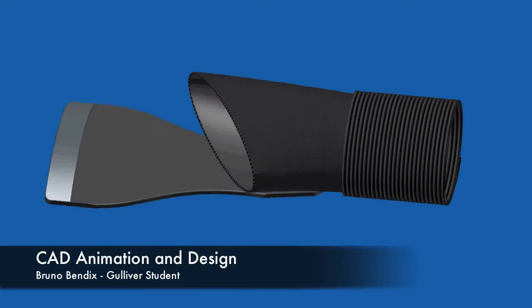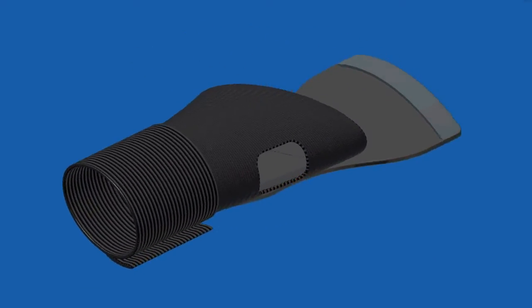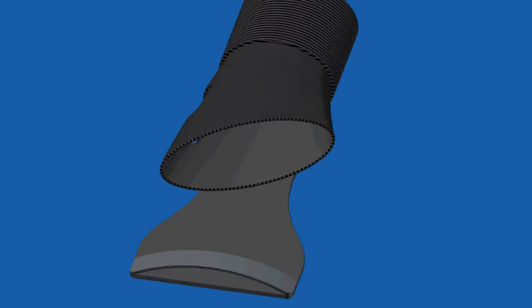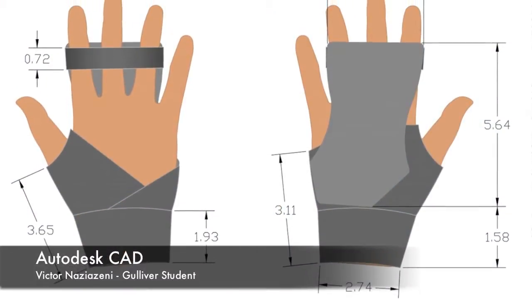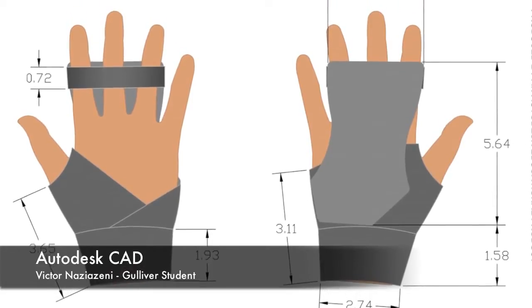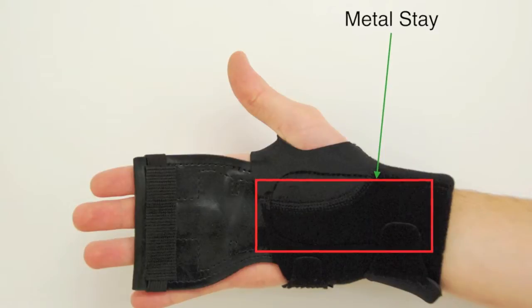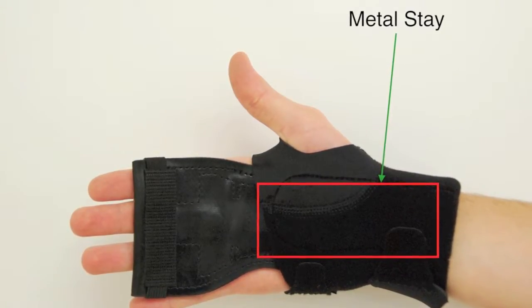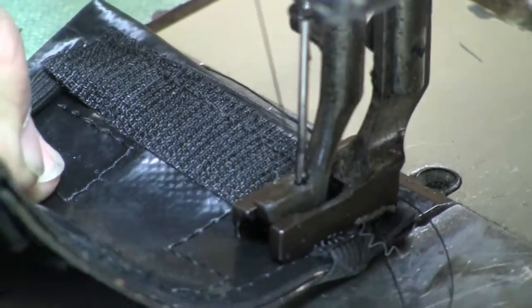Our engineering team has developed the hand-operated lifting device, the Hold, an ergonomic glove designed to stabilize the wrist while transferring weight from the user's fingers to their forearm. The final Hold was constructed by using CAD models to determine the measurements of the neoprene fabric which would be sewn. By overlapping the neoprene, pockets were made for removable metal stays which stabilized the wrist.